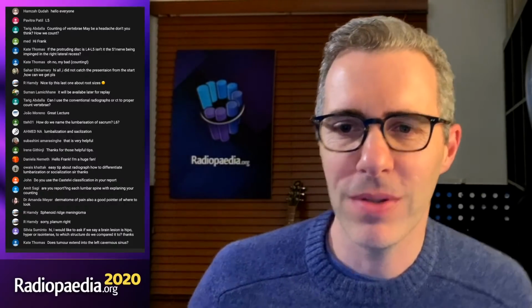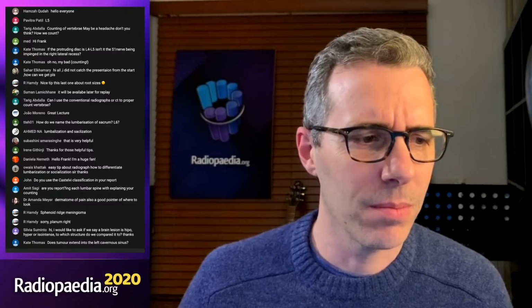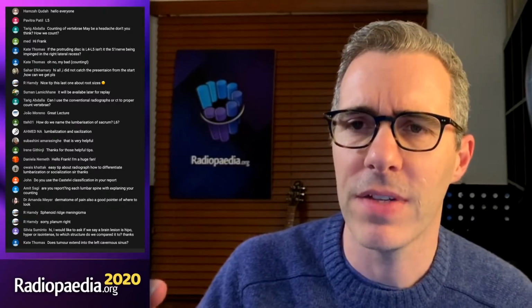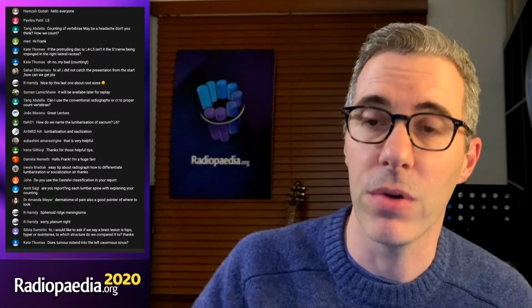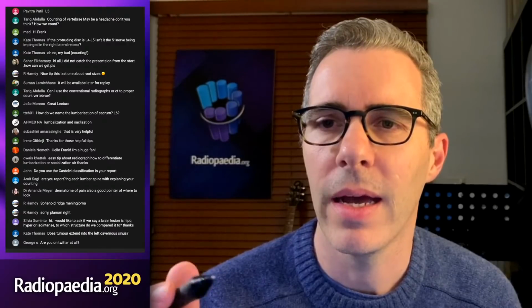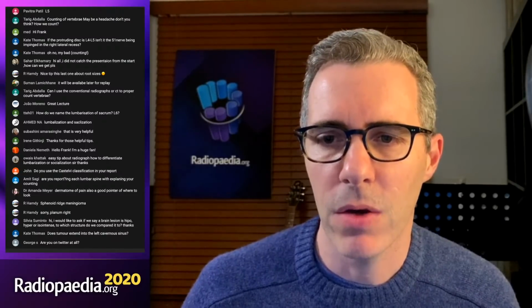So sphenoid meningioma, not quite. That's really planum sphenoidale, which is that flat blip. We don't have a sagittal image to show that this goes back and probably creeps into the pituitary fossa, making it a tuberculum sella meningioma.